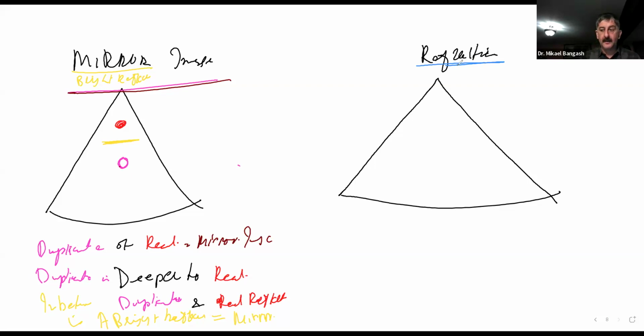That bend in the transmission angle, which, like your mirror image, is going to produce a duplicate. But the first thing that we need is that the beam or pulse needs to refract.